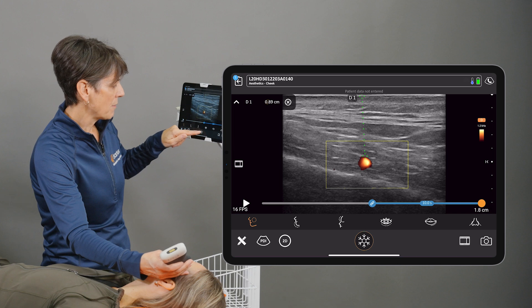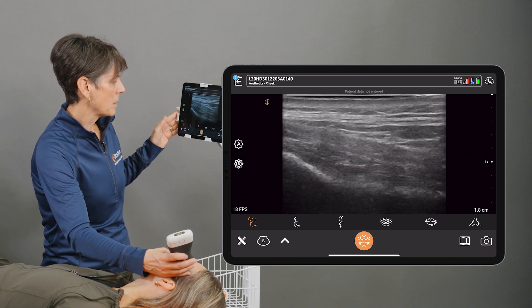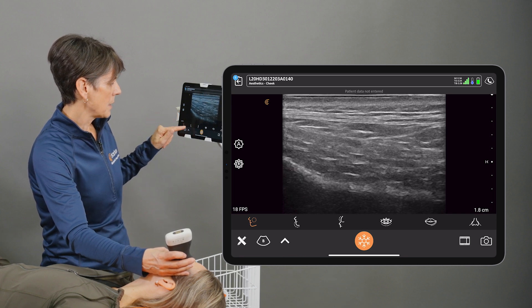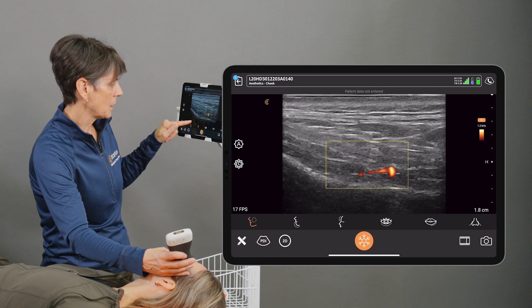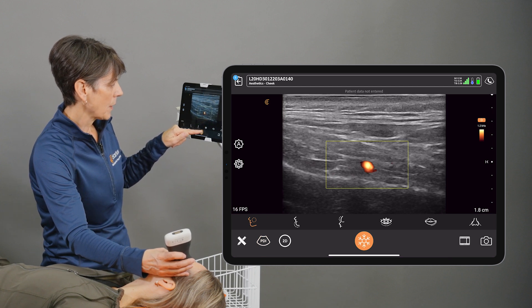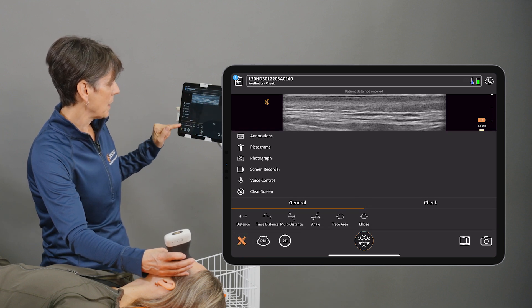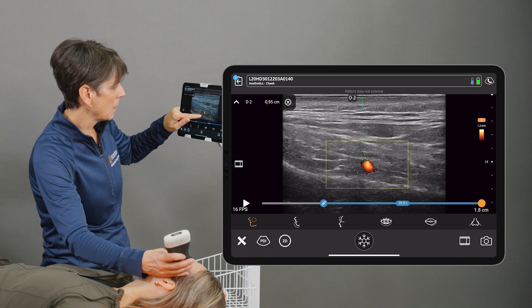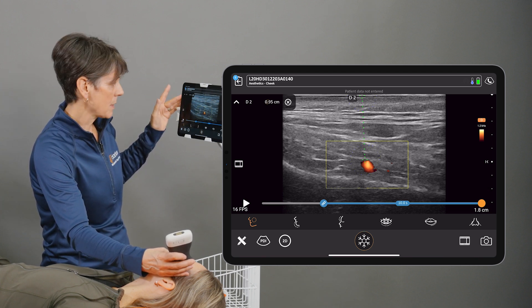If I unfreeze the image and go back to 2D imaging again — the way I did that was I turned on my power Doppler, freeze the image, go into the tools menu and locate the distance tool, and measure the depth down to that vessel.